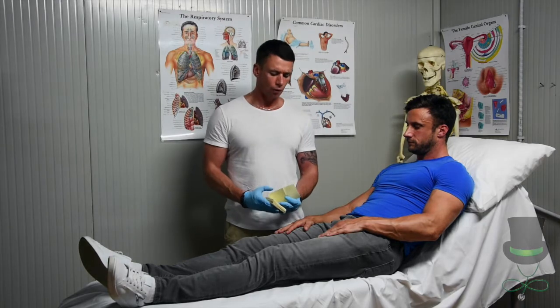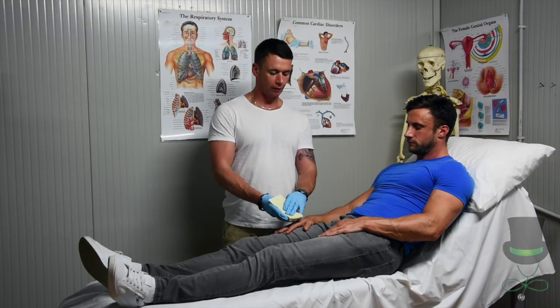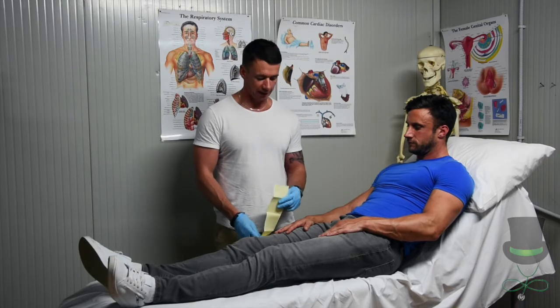The gauze comes folded like so. We don't apply all the folded gauze directly into the wound — we must open it out to pack it in.